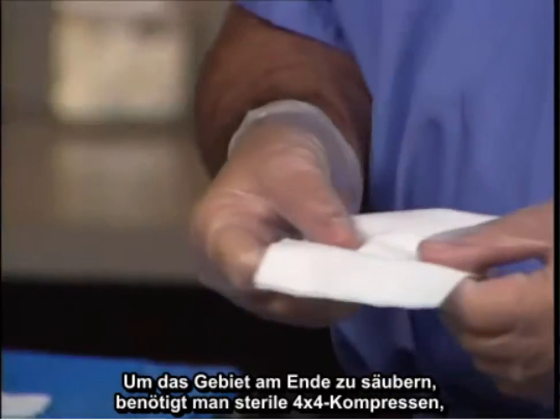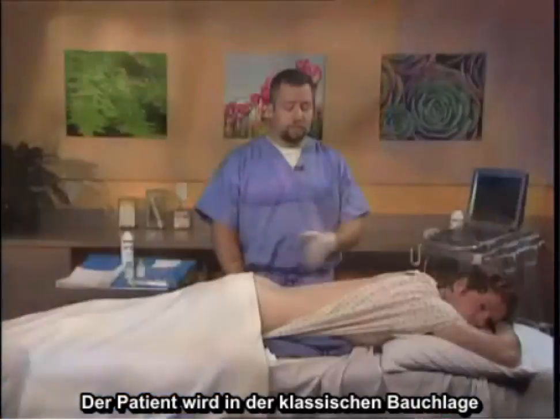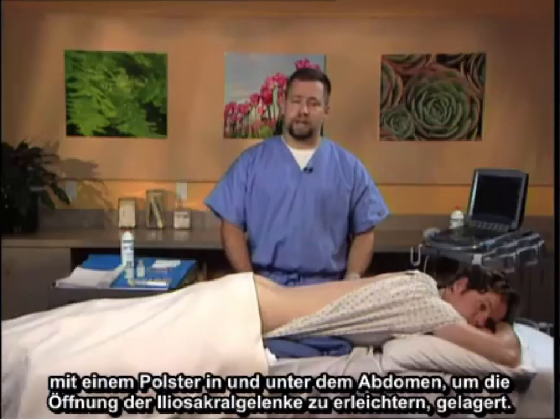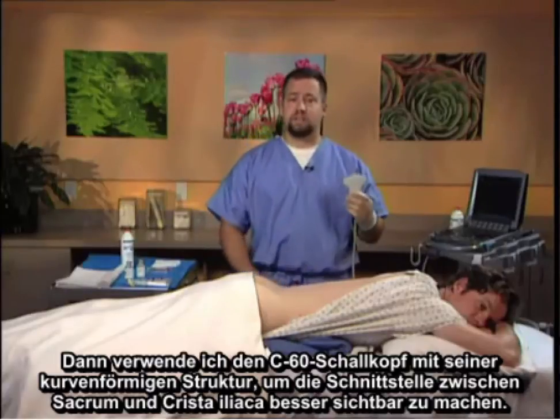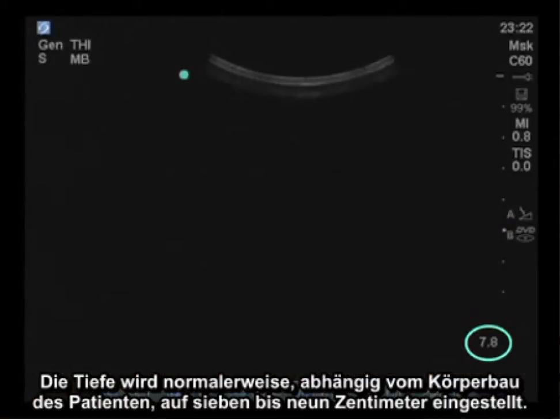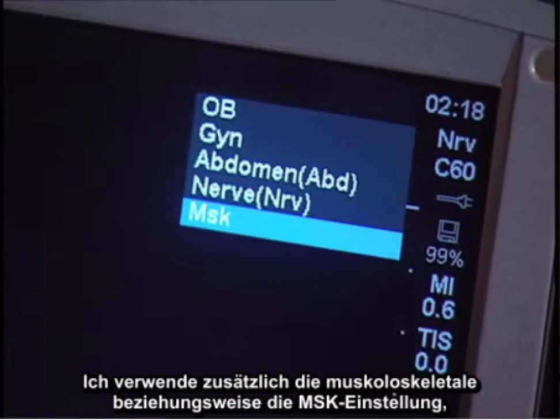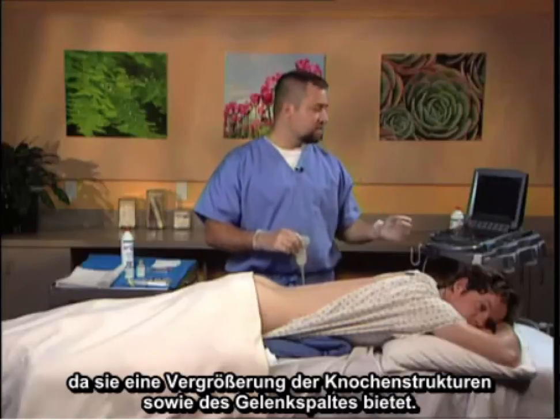The patient is placed in the traditional prone position. There is a bolster under the abdomen to facilitate opening of the sacroiliac joints. I utilize the C60 probe with its curvilinear structure to better visualize the interface between the sacrum and the iliac crest. The depth is usually set to 7 to 9 centimeters depending on the patient's habitus. I utilize the MSK setting because it provides enhancement of the bony structures and the joint space.